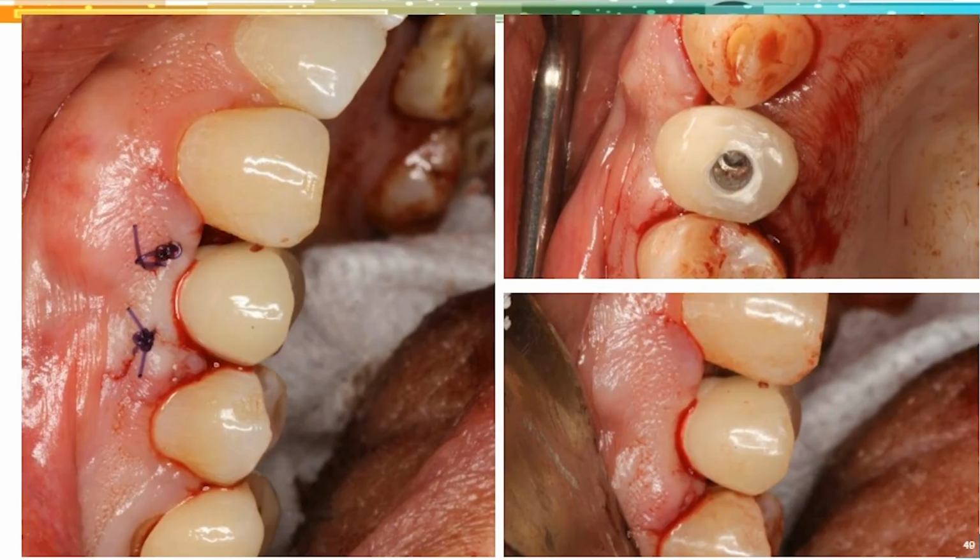And then this can go back to the patient's mouth, and they leave with a tooth that day. So it's out of occlusion, it's out of excursive, and so on. But now we're already forming the gingiva. We're not going to lose the papilla. We're going to gain papilla, and then we just take a final impression in 3 or 4 months. We're ready to go. So these are the kind of things that having this digital technology, and the more comfortable you are, you can leverage a lot of these tools to have a better patient experience.